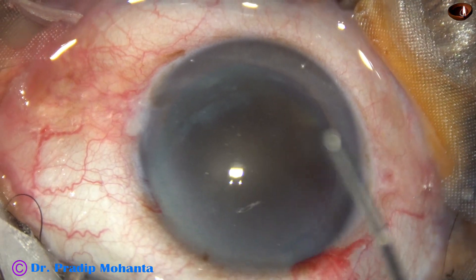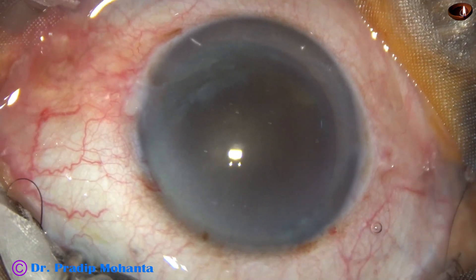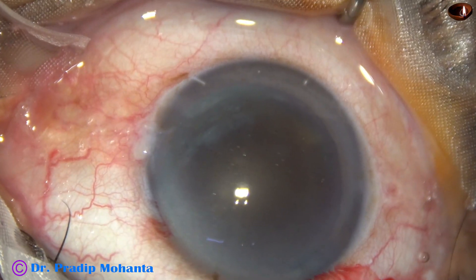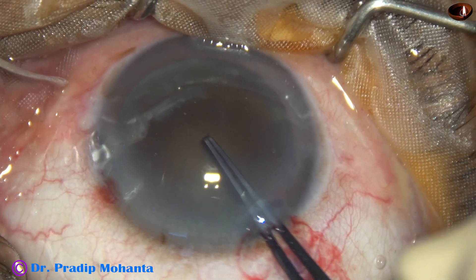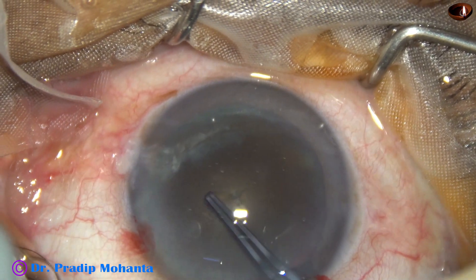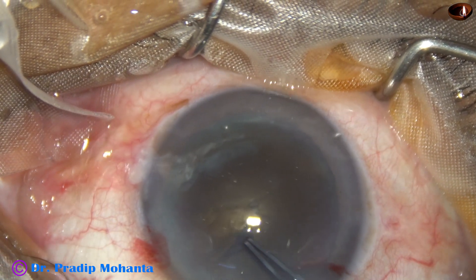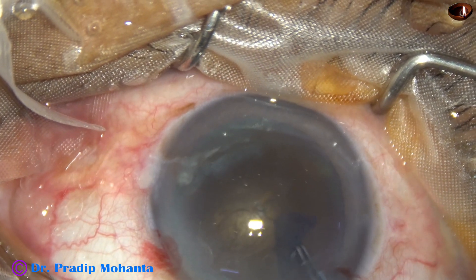The anterior chamber is filled up with 2% hydroxypropyl methyl cellulose. Now a utrata forceps is being used for capsulorhexis. The anterior capsule is punctured at the center. A capsular tag is raised and this capsular tag is being guided anti-clockwise all around to get a large rhexis.